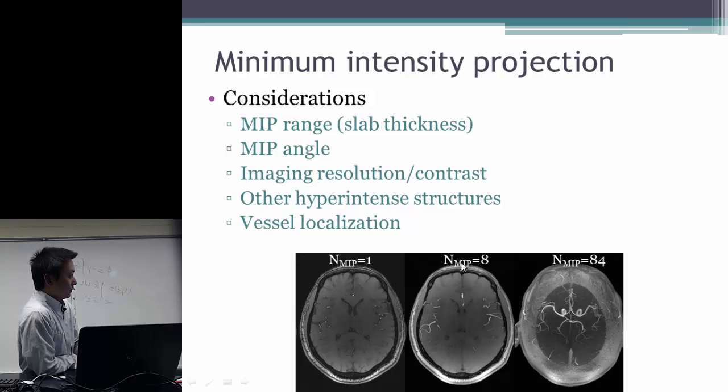But for this one or this one, you can see the whole vessel, but you don't know exactly along which slice this particular segment is located, and you do not know how it's curved along the projection direction.